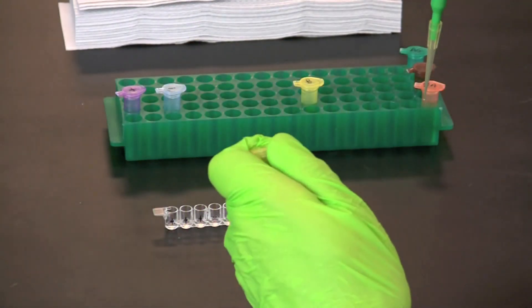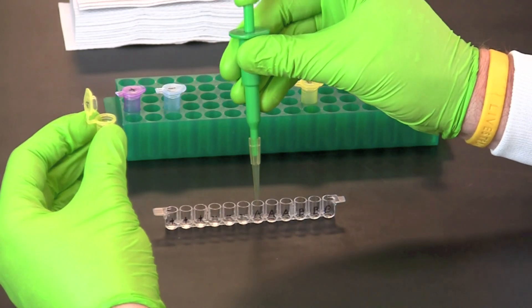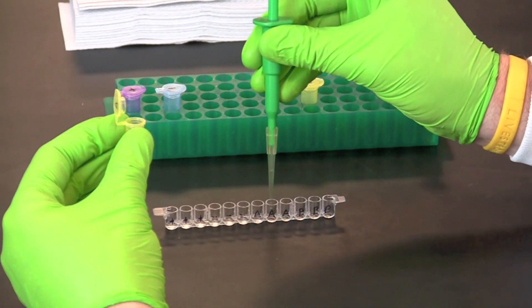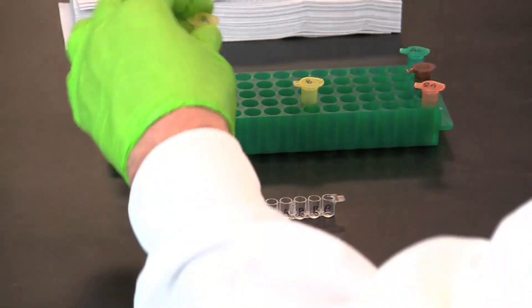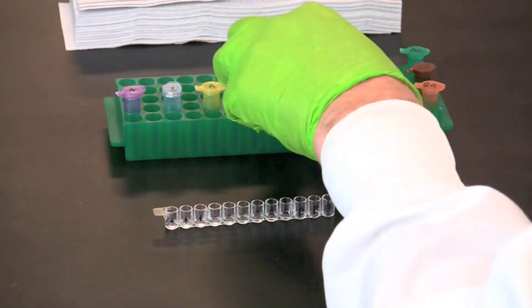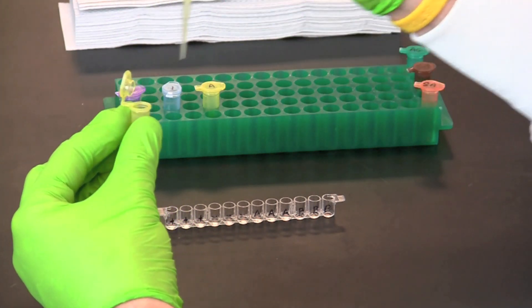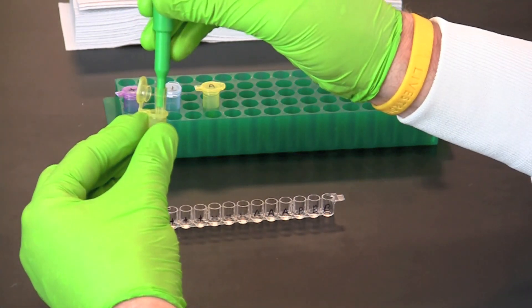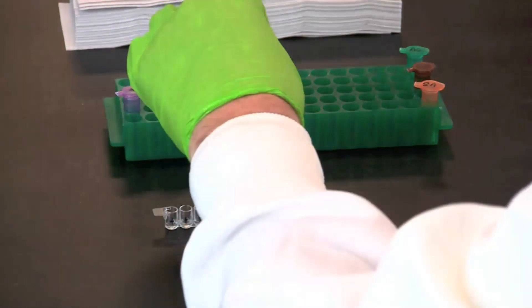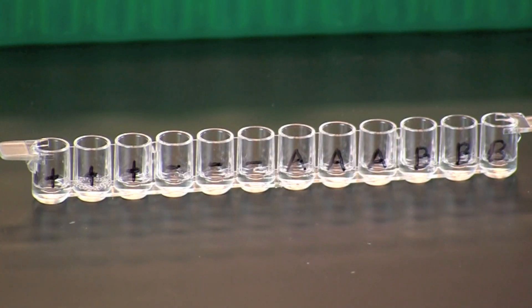Use a fresh pipette tip to transfer 50 microliters of each serum sample into the corresponding three wells. Remember to use a fresh pipette tip for each different serum sample. Incubate the samples for five minutes at room temperature so that the serum antibodies can bind to the antigens.